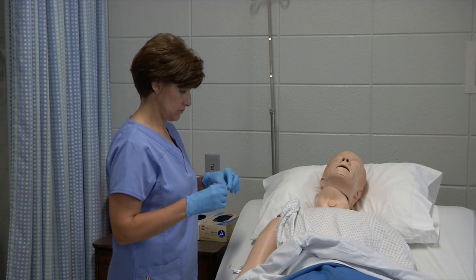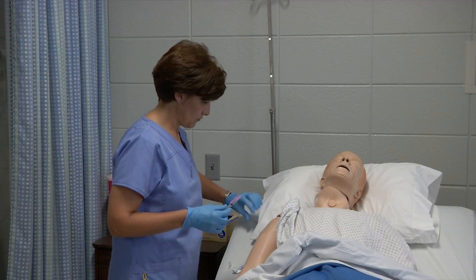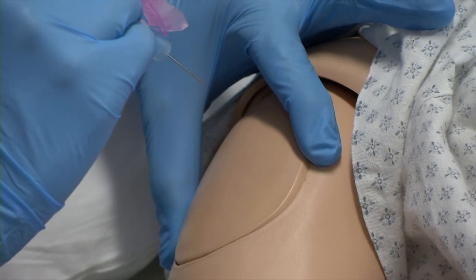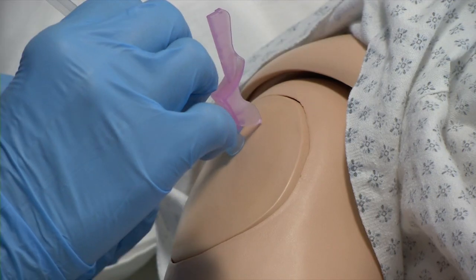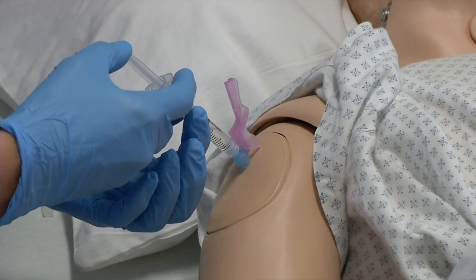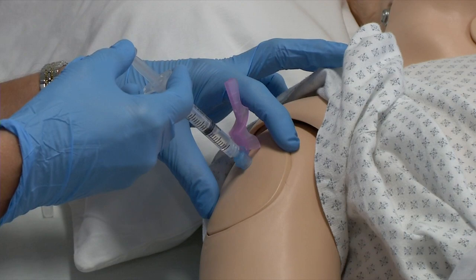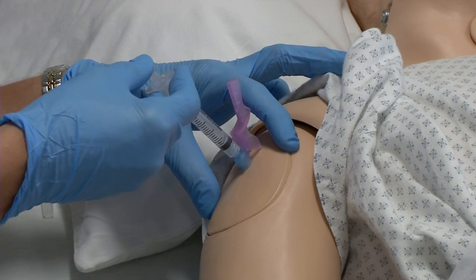Once it is dry, you're going to isolate the muscle, remove the cap. At a 90-degree angle, you're going to inject the medication. You're going to pull back on the plunger to ensure that you have no blood. Then you're going to inject the medication for the amount of time that is recommended by the manufacturer.